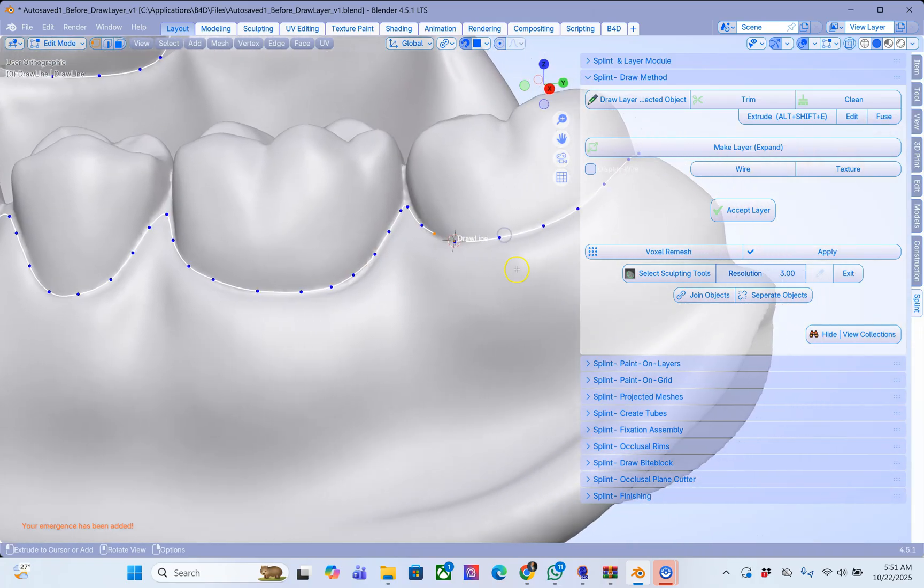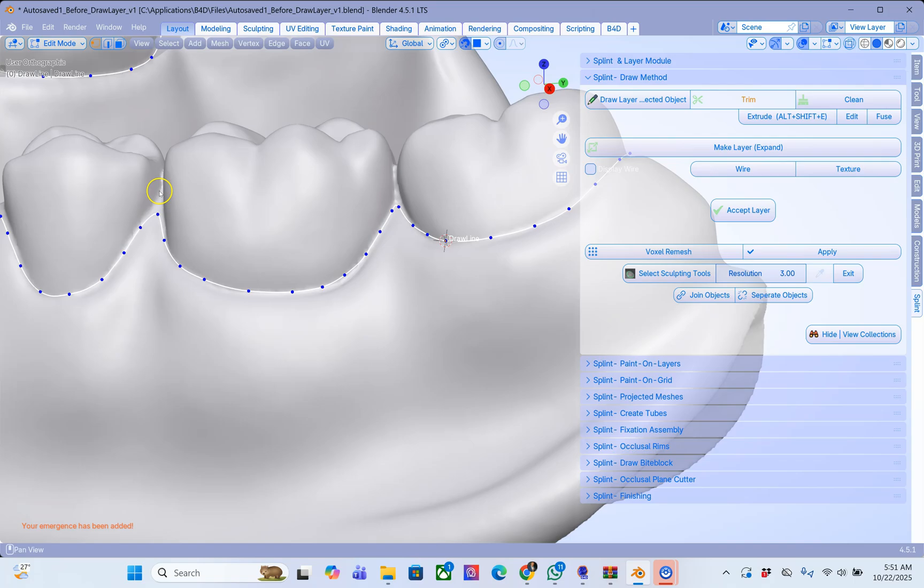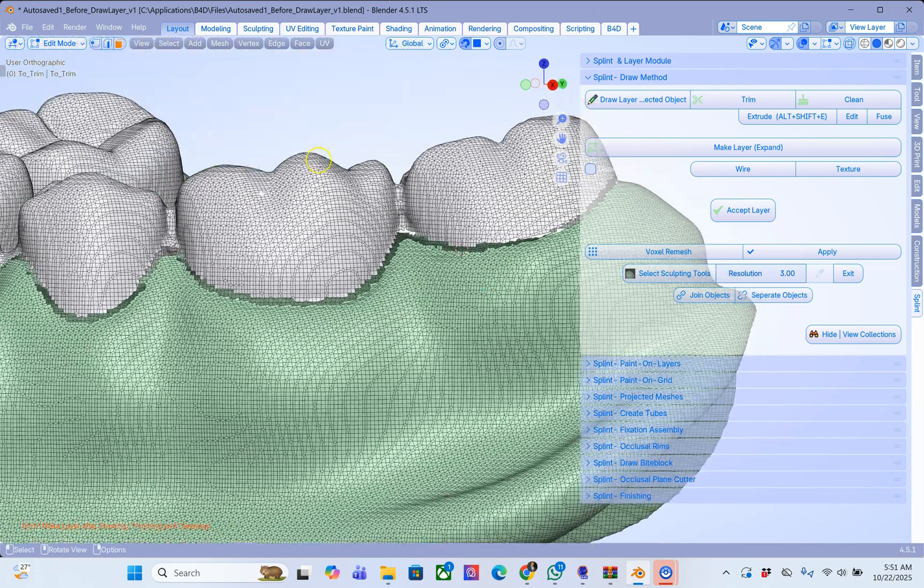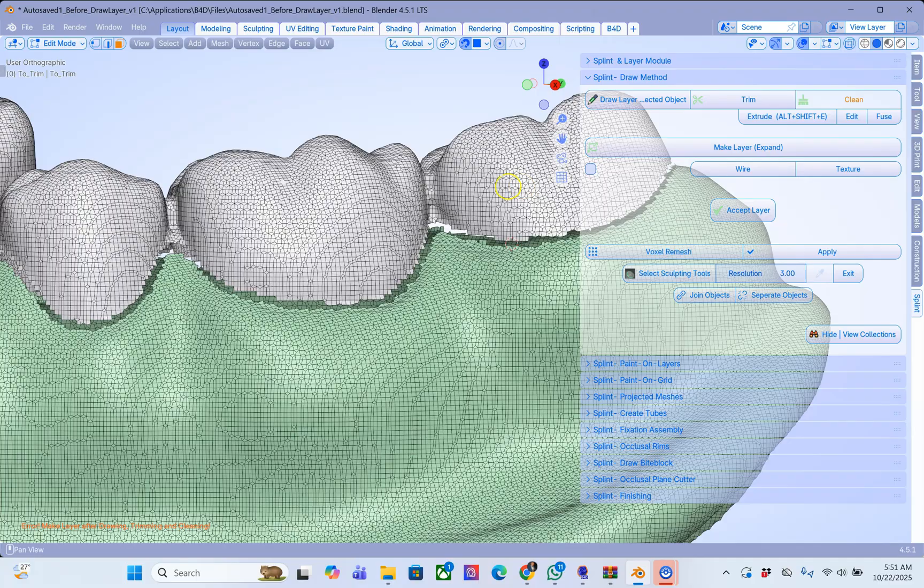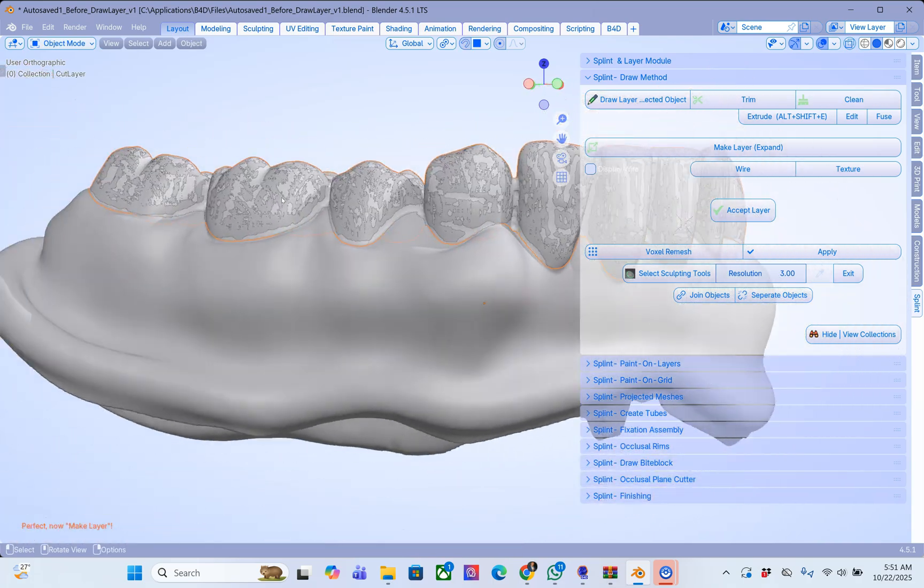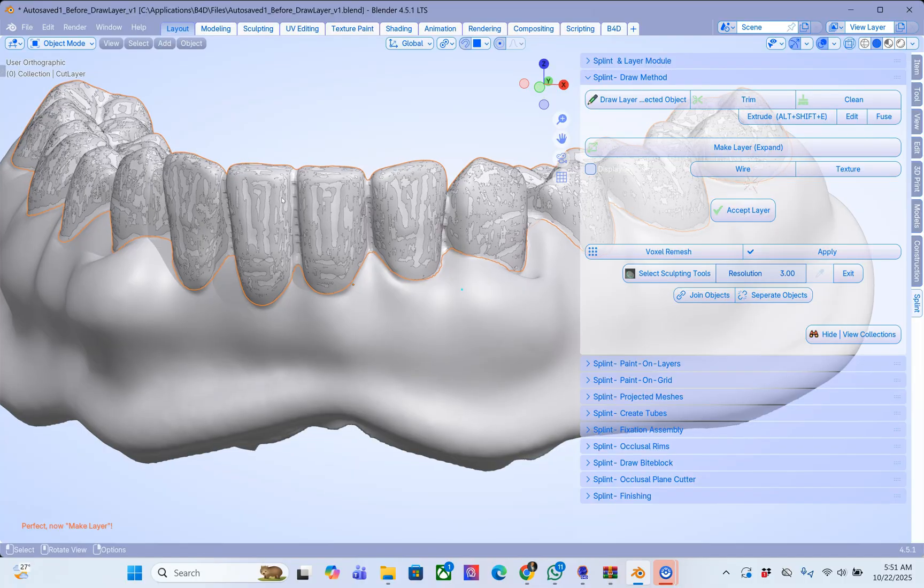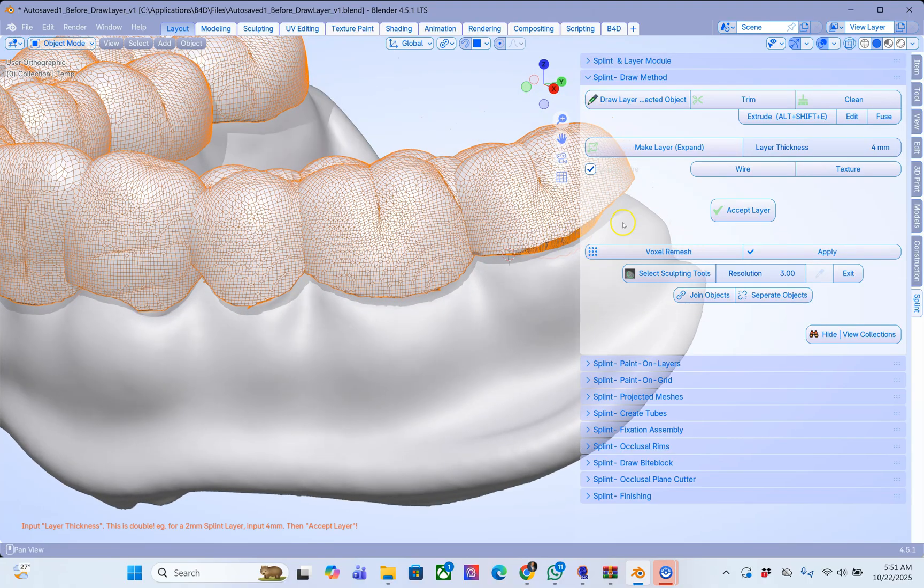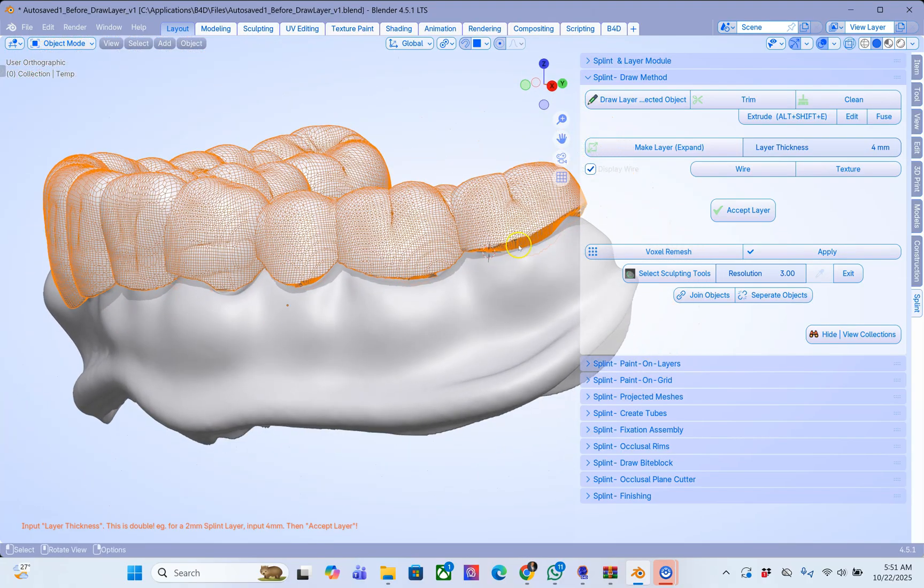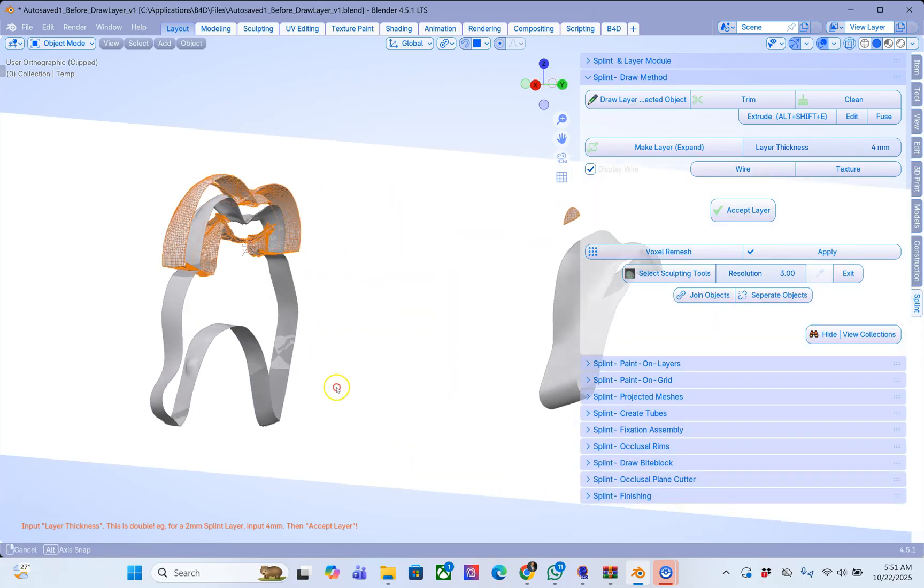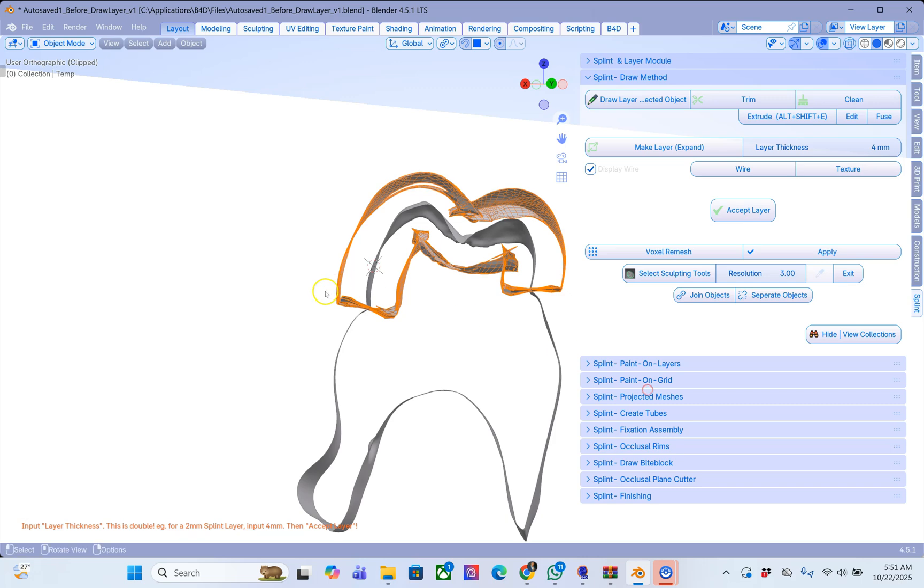When I get to the other side I'm going to click on fuse. Click on trim. Then select the mesh that you want to keep and click on clean. What this has done is it's going to duplicate the surface and create a copy surface on top of it. I'm sure you know where I'm heading with this. Make your layer and now you have to decide how deep you want to make this layer.